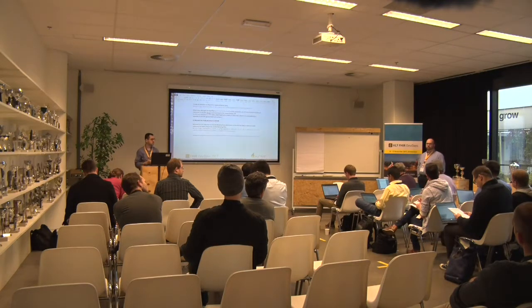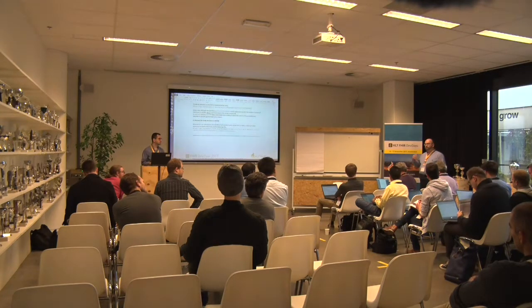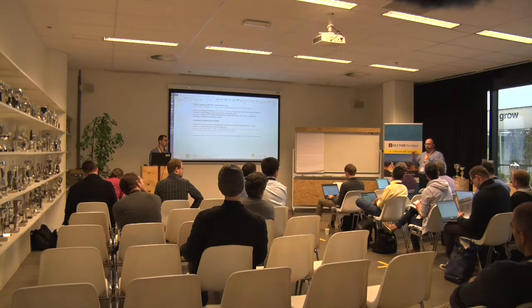A really good example would be what if the patient name is changed on the DICOM objects. A lot of the times you don't even update the files on disk. Usually it's only when it gets sent out. But that's something that services that layer on top of it would rewrite the DICOM header as it's sending out that file. So there's definitely a lot of cases where they'll fall out of sync, and that's kind of the reality of how DICOM packages up its files with this metadata embedded within the image itself.